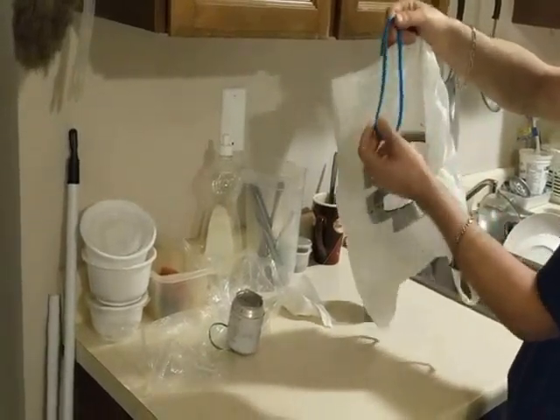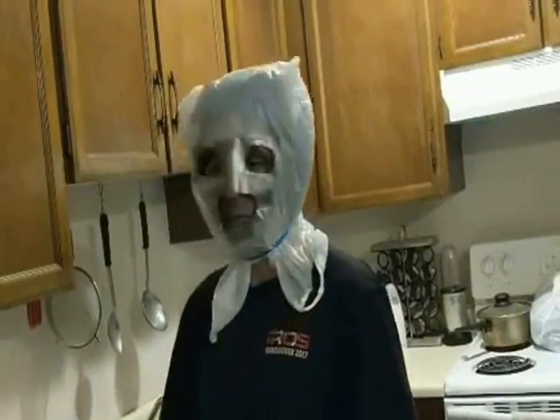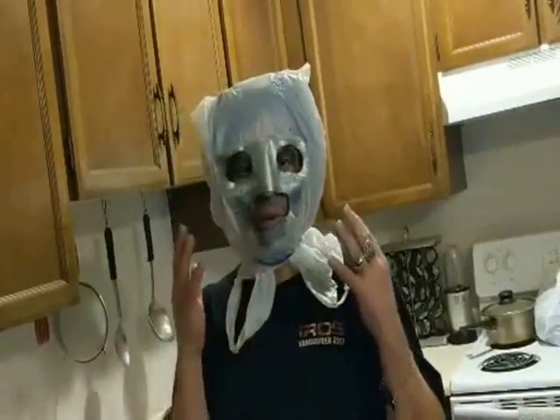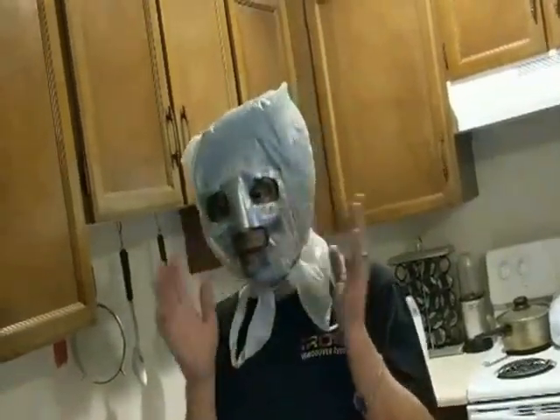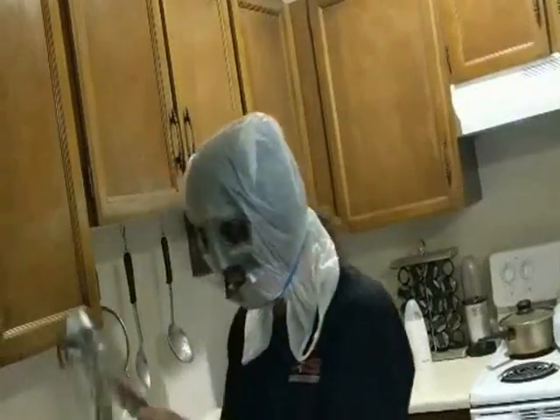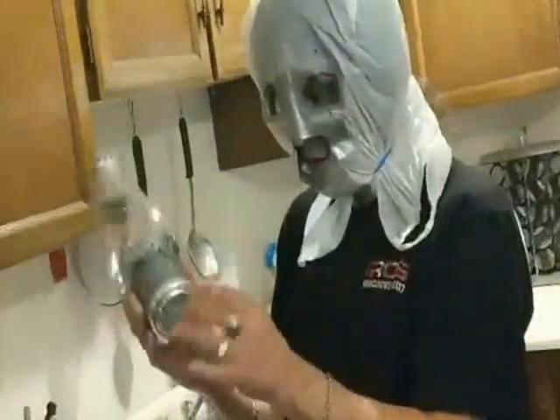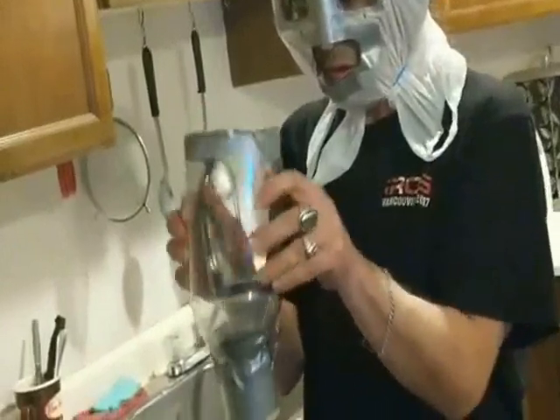So we're going to move on to how to make the mask. Okay, so you can see me with the plastic mask over top of my head. I do have the elastic band around my neck. It is a larger one. Please make sure that you choose a larger one. You do not want to choke. As you can see, I have the filtration mask. You could use that along with an N95 mask or the shield mask. It can work in conjunction with the plastic mask.